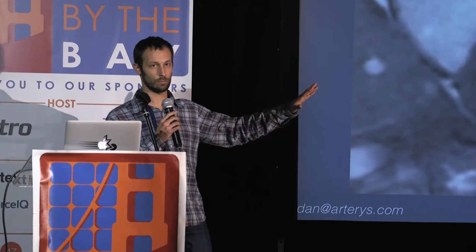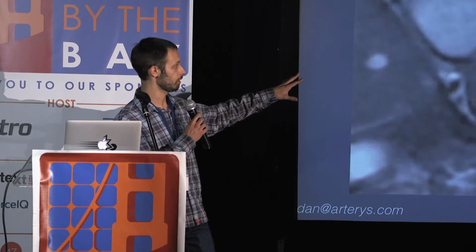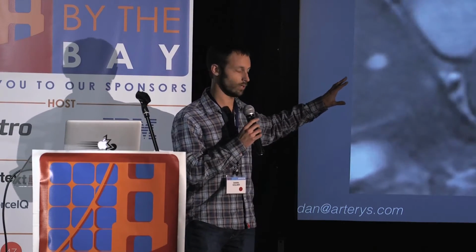That's a newer type of cardiac MRI, but because a lot of institutions still use this legacy method, SSFP, we are working on products to support that legacy data type. So I'll be talking about this kind of MRI.